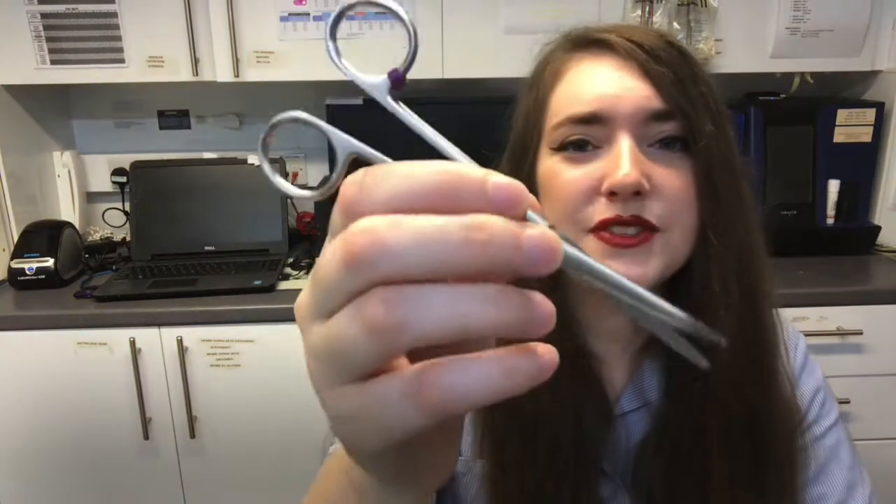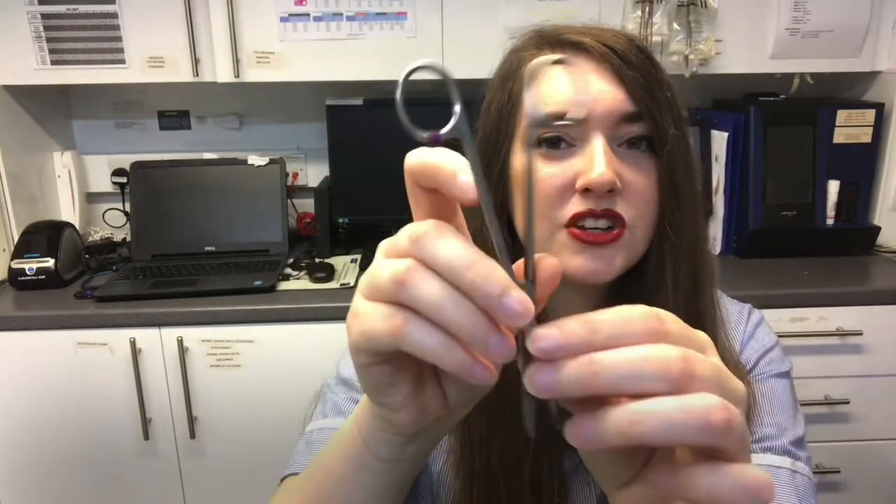Lastly, we have some scissors here to cut any tissue that's no longer needed.